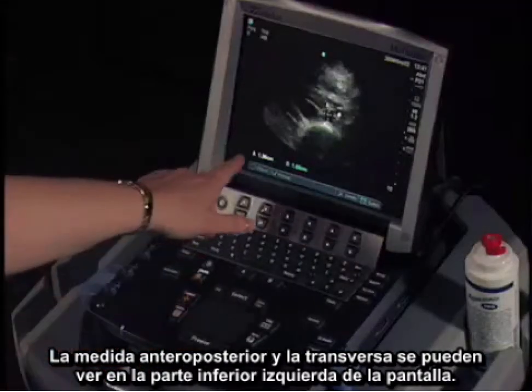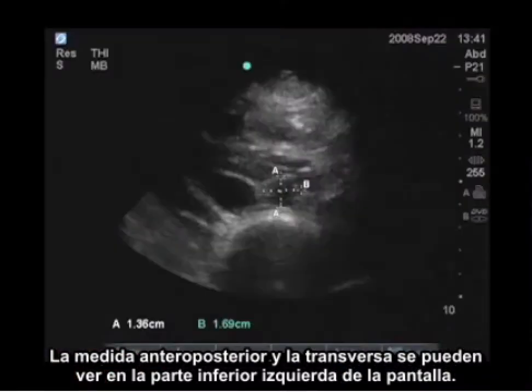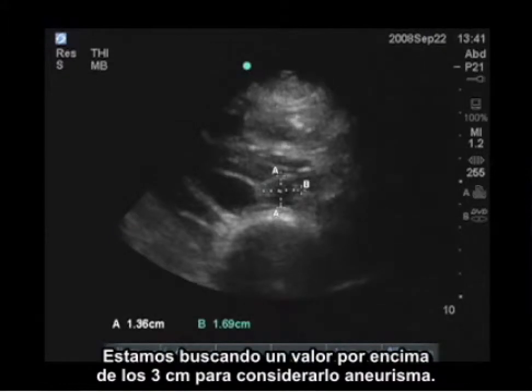The measurement is displayed on the bottom left of the screen, and in this case, our measurement is 1.36 centimeters by 1.69 centimeters. We're looking for a value of over 3 centimeters to be considered aneurysmal.